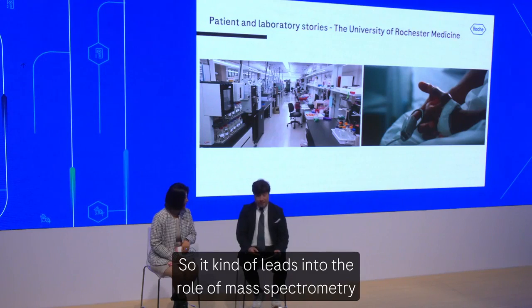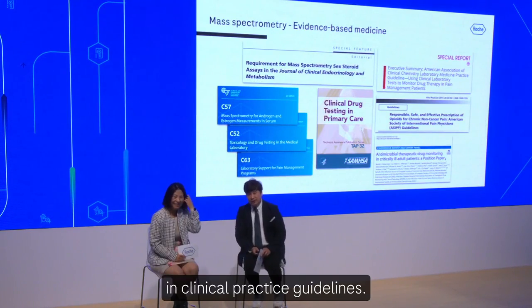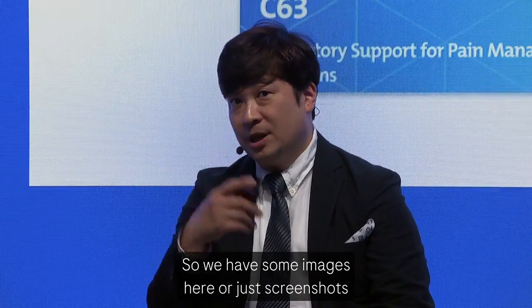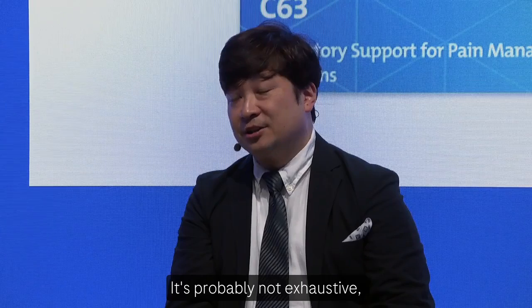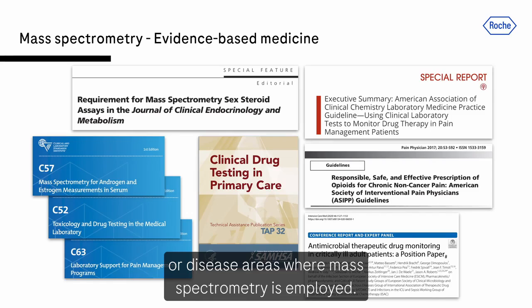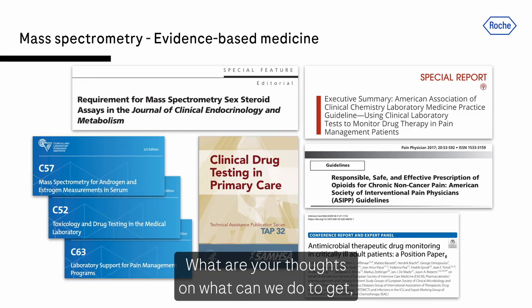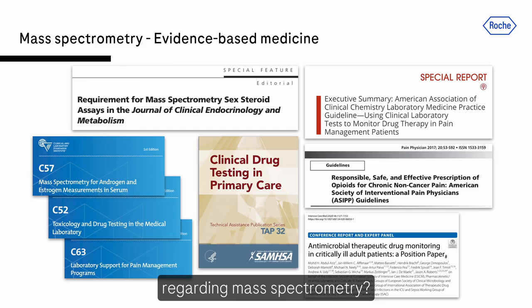So, that kind of leads into the role of mass spectrometry in clinical practice guidelines. We have some screenshots of various guidelines. It's probably not exhaustive, but you can see there are various disease areas where mass spectrometry is employed. What are your thoughts on what we can do, or can we do more, for patient care and work with clinicians regarding mass spectrometry?